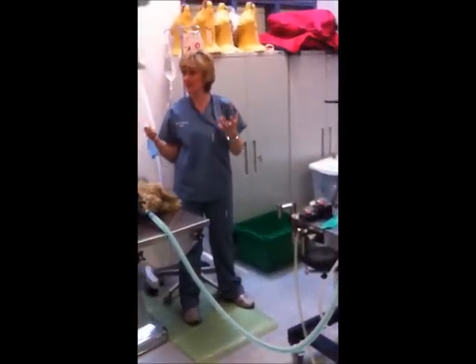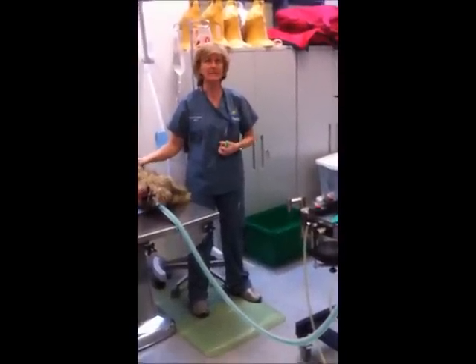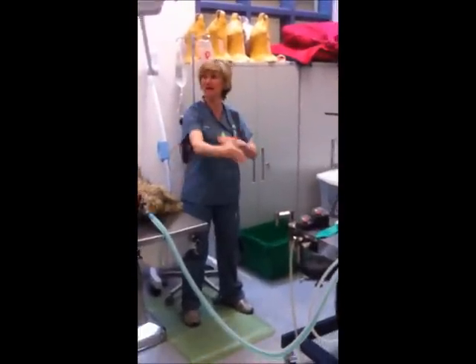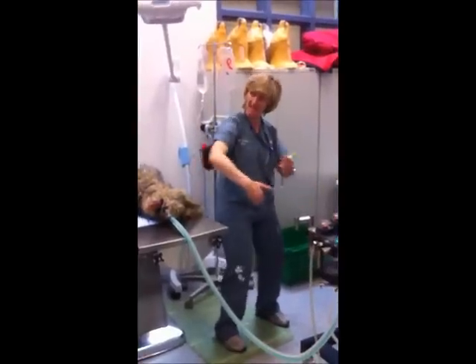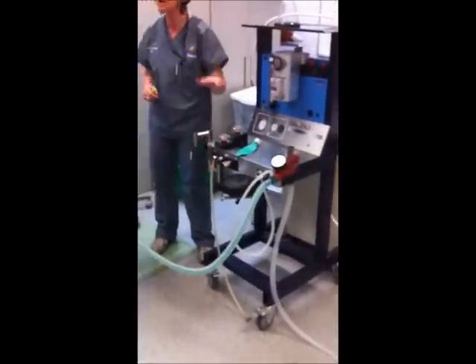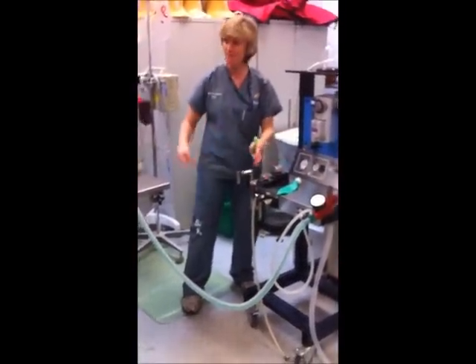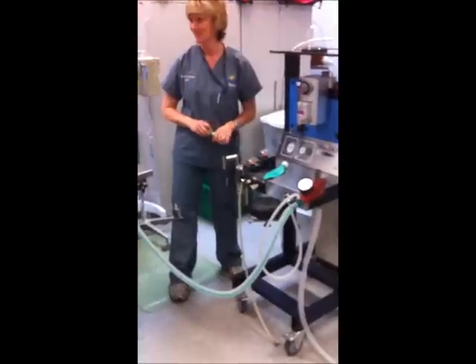Right, but what you should be clear on is why. Why rebreathing for a bigger animal? Bigger lungs? Not just bigger lungs. As the anesthetic slows things down, they tend to have more strength to move air back and forth, because this circle system has something to do with the animal breathing in and out. Remember, I'm spoon feeding it. My flow rates on the non-rebreathing system are much, much higher for my animal. They're getting lots and lots, more than they need almost. Where with this system, his breathing somewhat drives the gas that he gets. Somewhat.